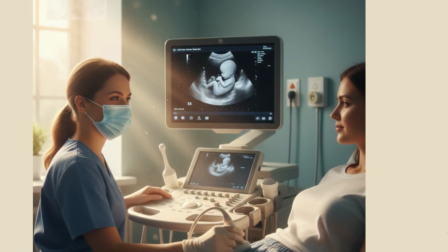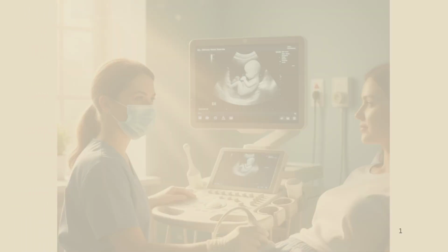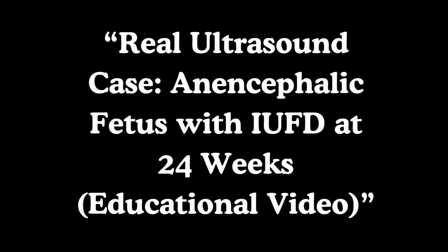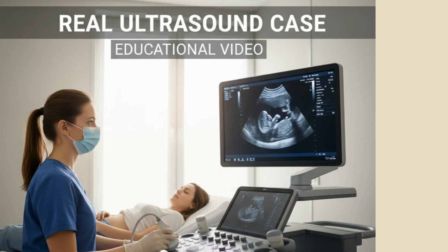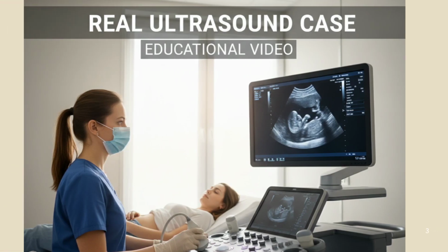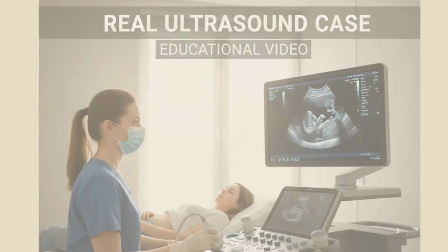Sometimes, even before life begins, nature writes a different story. This ultrasound at 24 weeks reveals a heartbreaking yet powerful lesson: an anencephalic fetus with intrauterine fetal demise. Let's understand what went wrong, how it happens, and why early detection is so important.